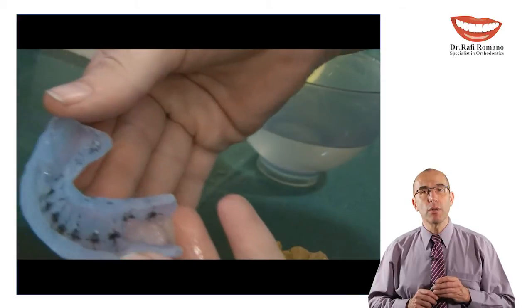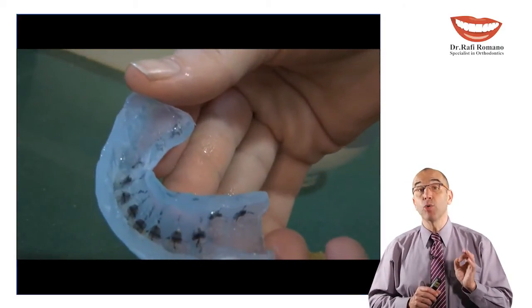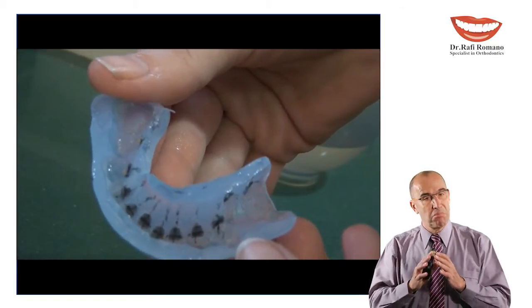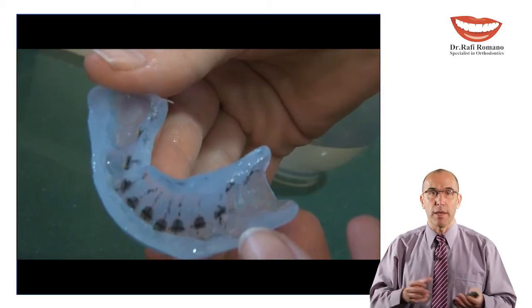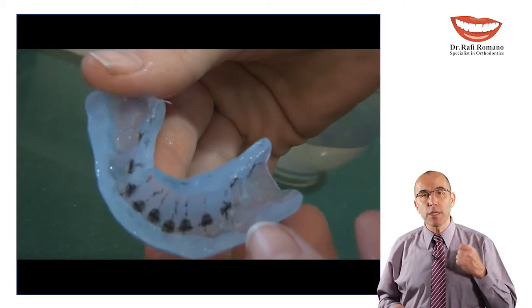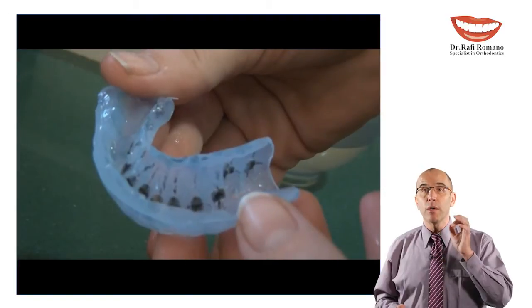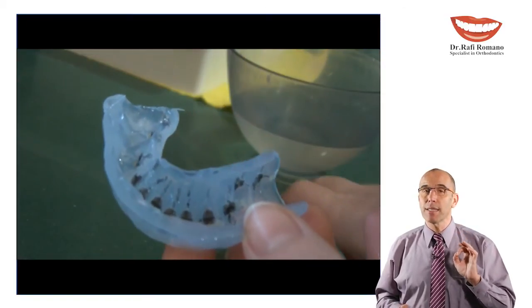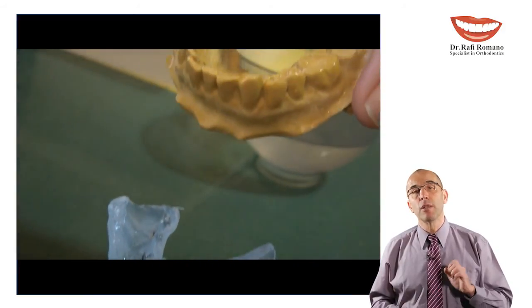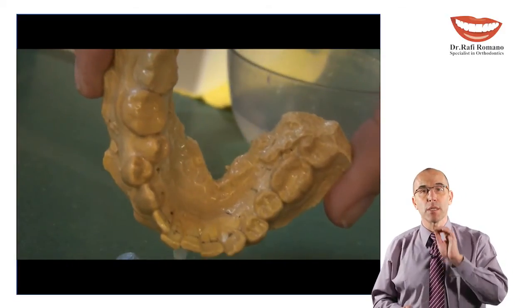All this procedure is done in my clinic very accurately. You will see cases done with this technique, indirect bonding. The cost is nothing. It's only the cost of this material, which is very minimal. And the procedure is very accurate and very good for minimal teeth movement, and even moderate teeth movement, not the most complicated cases, you can do with this indirect technique.